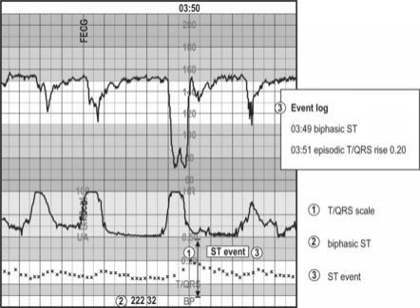However, when lumping together all the studies, they found that the decrease in intervention seen by Westgate disappeared. If you look at the studies, you can see how as the years go on, the differences between the groups all but vanishes. In the 1992 Westgate study, it was 40.7% versus 33.2%. In the 2001 Amber-Whalen study, it was 20.4 versus 18.1. In 2006, it was 15.4 versus 16. And in the largest study published by Belfort in 2015 with over 11,000 women, it was 22.2% versus 22.8%. Like I said, I think it just proves that Westgate had it wrong in 1992.